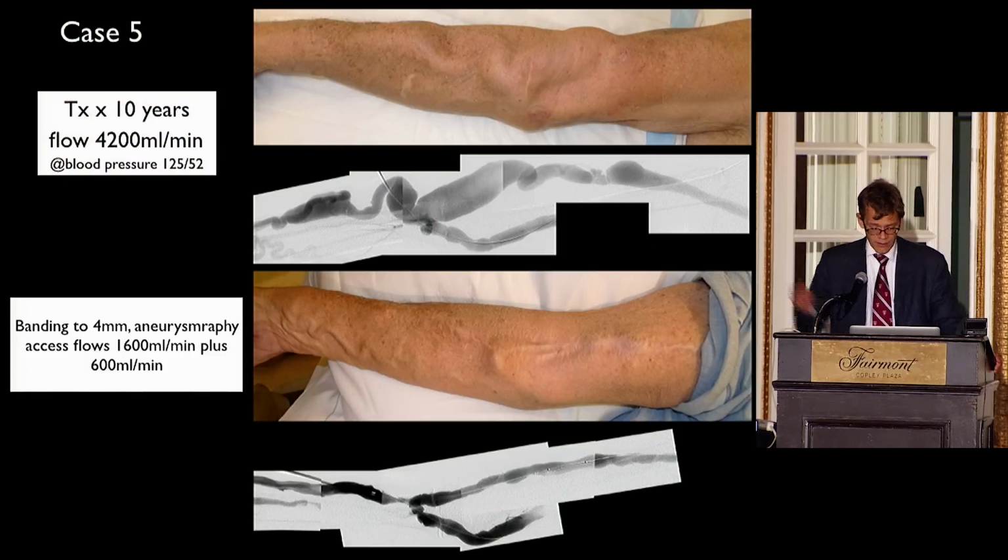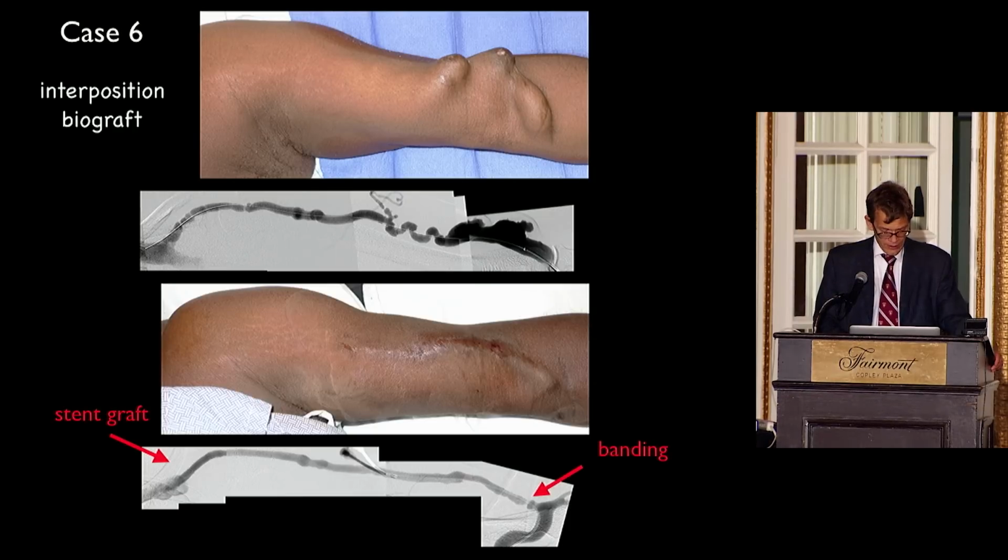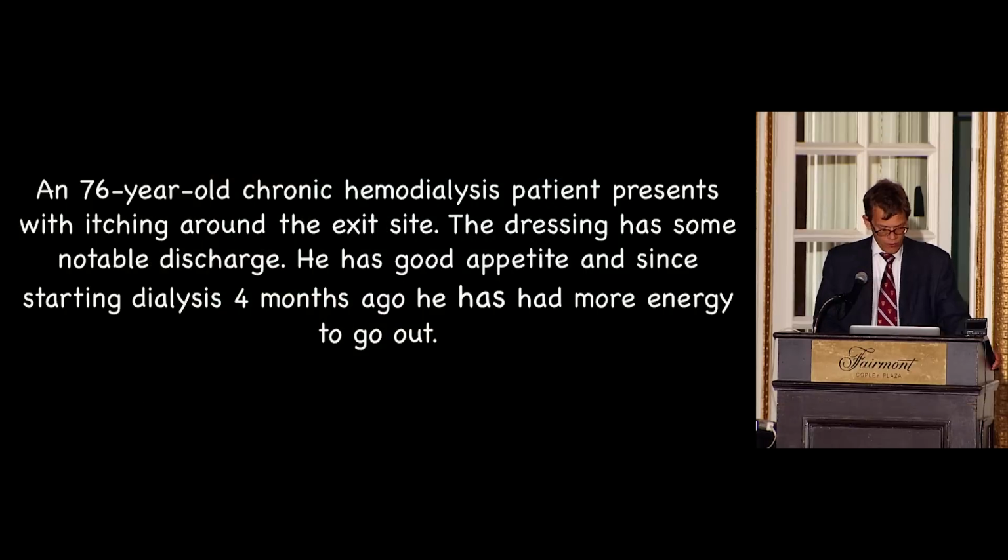So you can see that here, on top is before, bottom is after a very heroic intervention, I think 4 surgeries, but there's an obvious side effect of reducing the cardiac output, which I think has the key consequence for the long-term survival of these patients. Again, an example of outflow and inflow control.